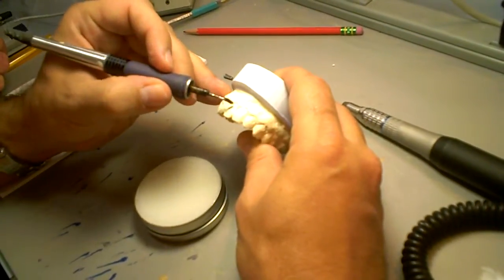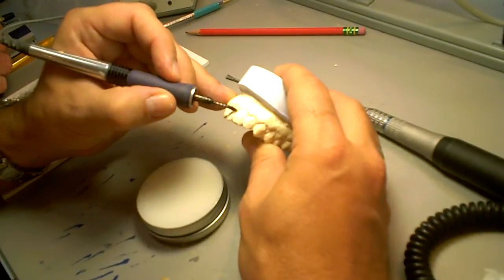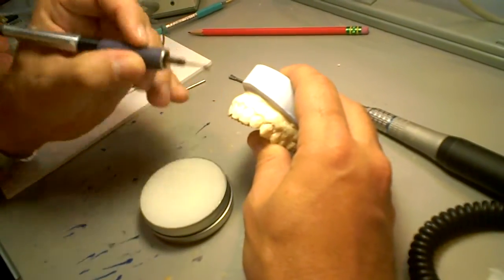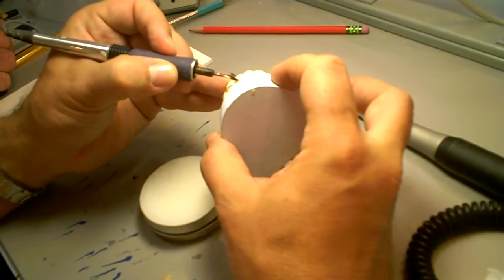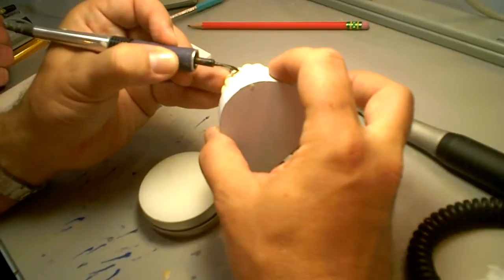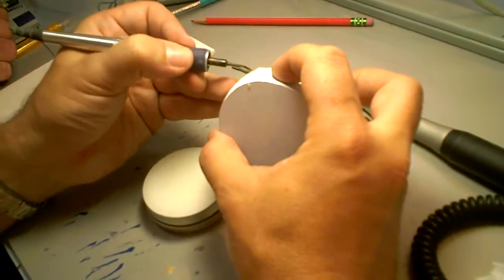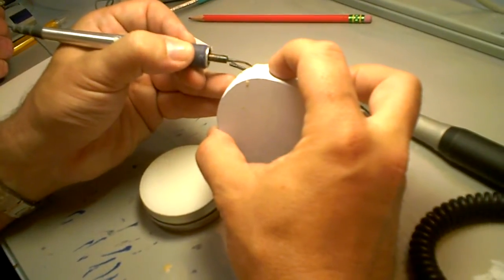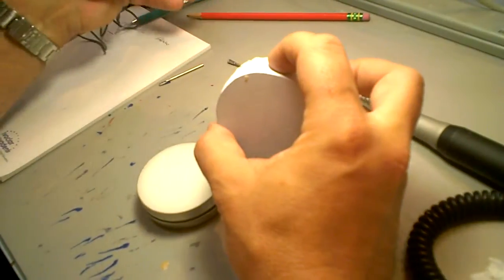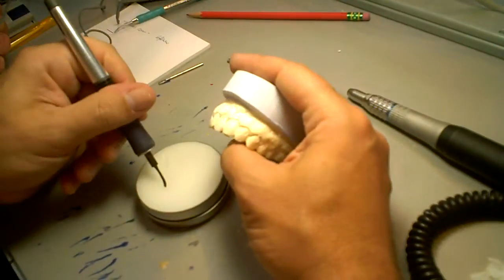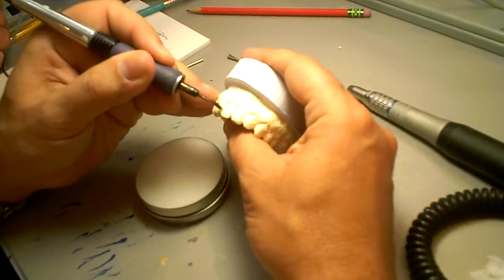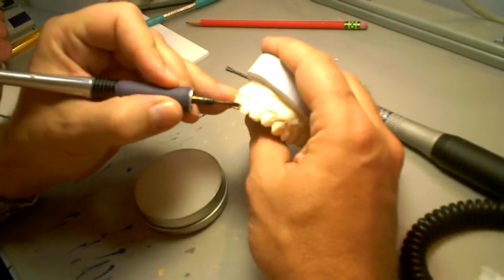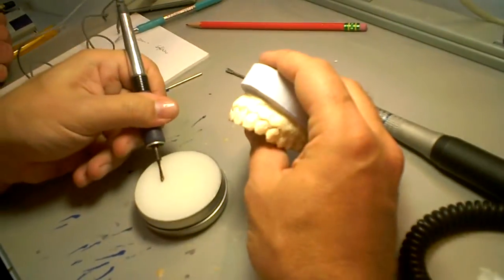So I build almost like I encase the tooth. I build the mesial and then I'll build the distal area. Always knowing, almost like imagining the patient's belly button out there. And I'm turning this here. So I'm always imagining the patient naked. Just kidding. That could be good or bad.